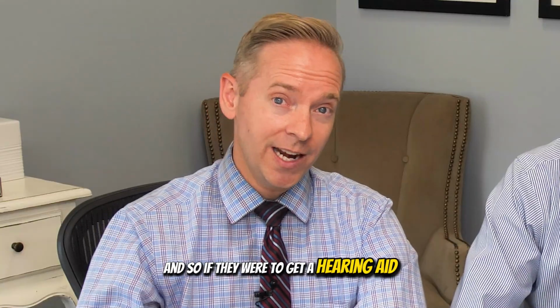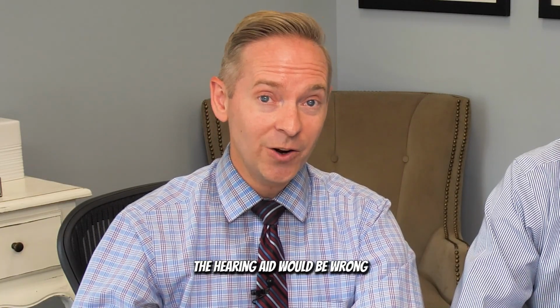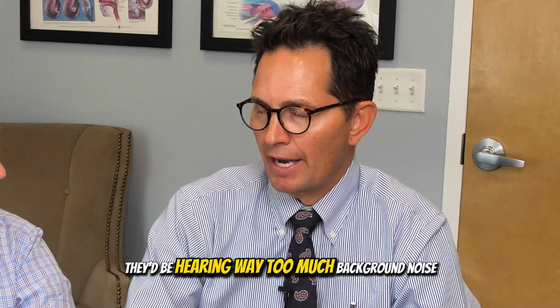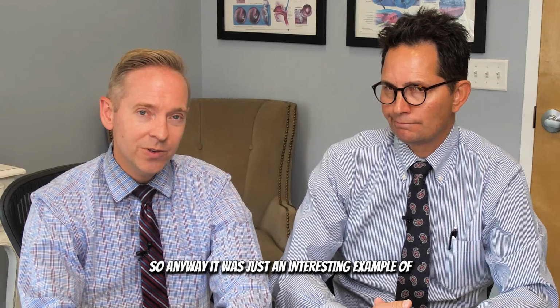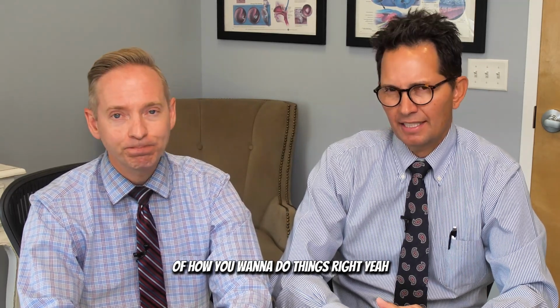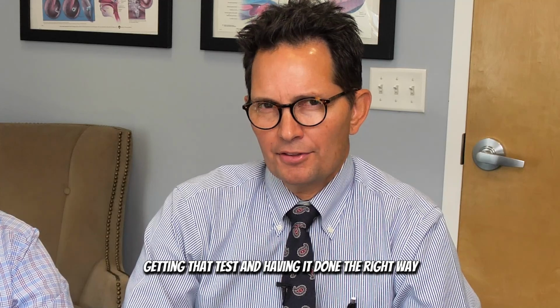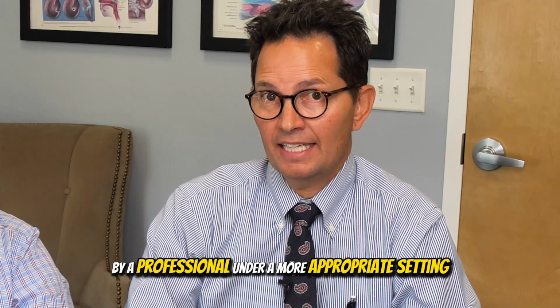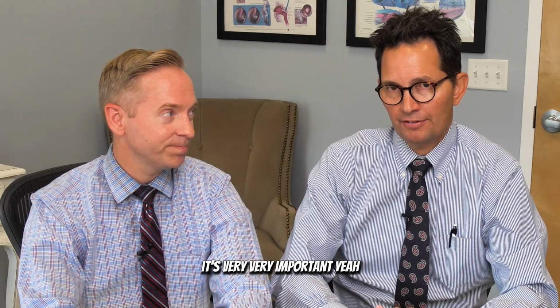And so if they were to get a hearing aid based off of that hearing test, the hearing aid would be wrong because the test was wrong. And they'd be hearing way too much background noise all the time. So anyway, it was just an interesting example of how you want to do things right. Yeah, getting that test and having it done the right way by a professional under a more appropriate setting. Pretty important. It's very, very important.